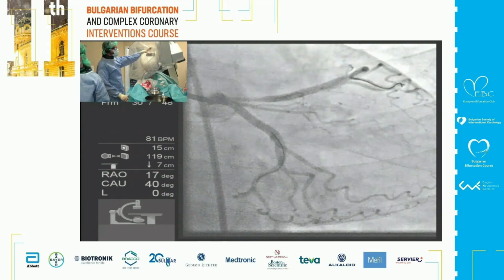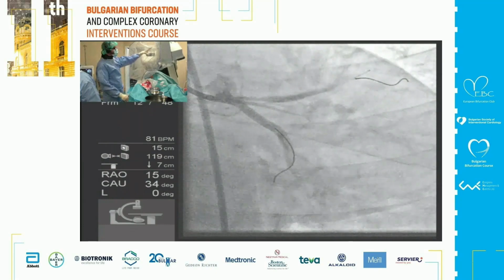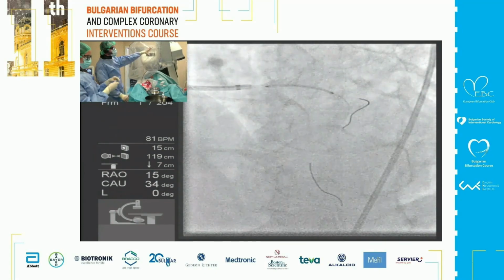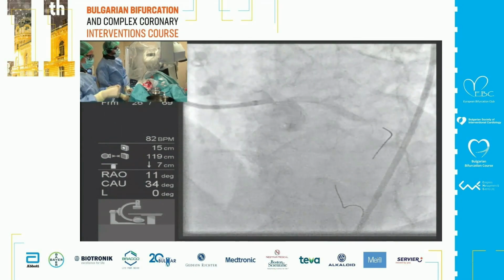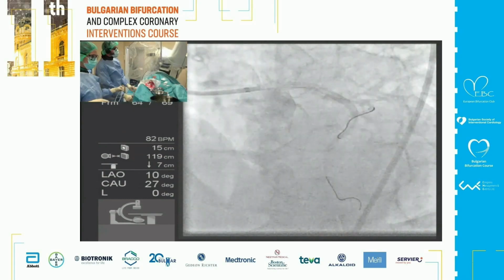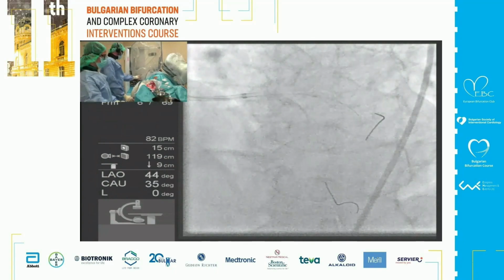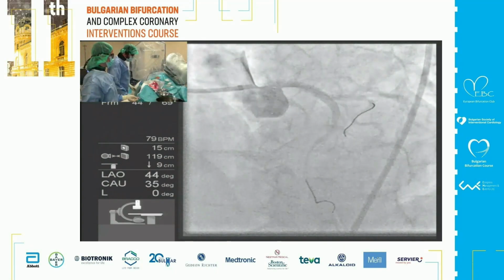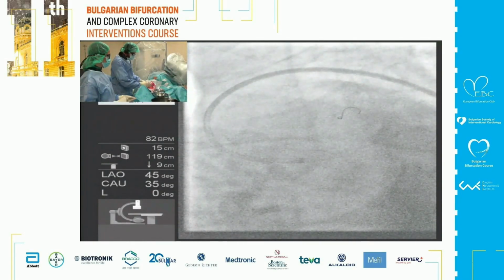Gabor Toth. Okay, can we have the result by angio? This is not the result, huh? No. So, yeah, this one. You can approach the left main carefully. Take care. Maybe I will take a balloon and go with the guide and the balloon on it, for the POT, to do the test. Okay. So a short 4.5. For me, if you want to do a 4.0.